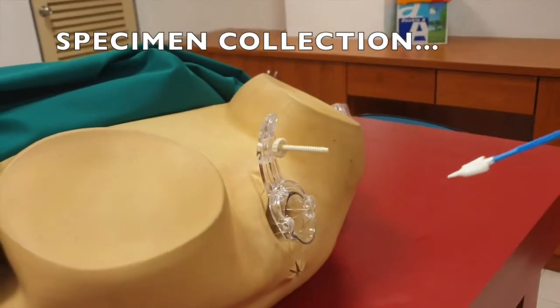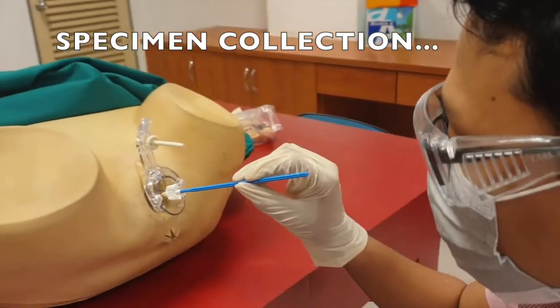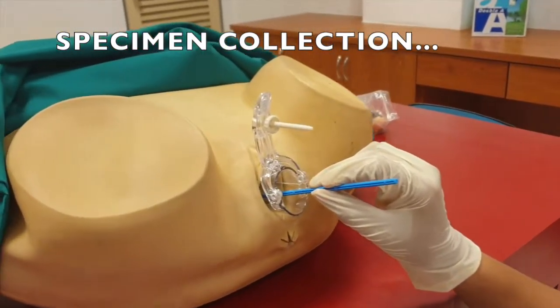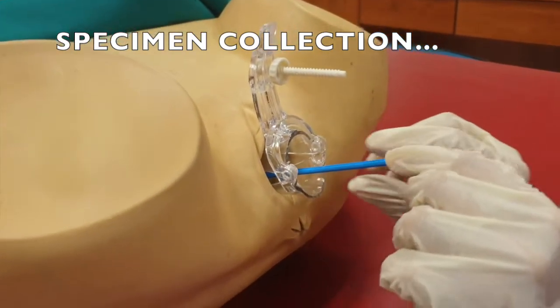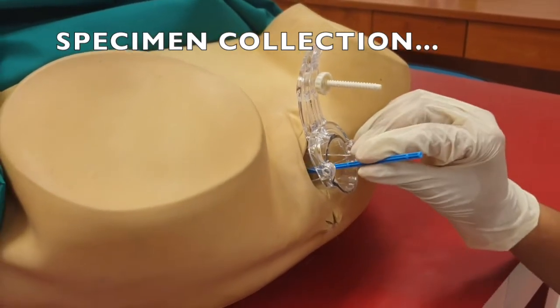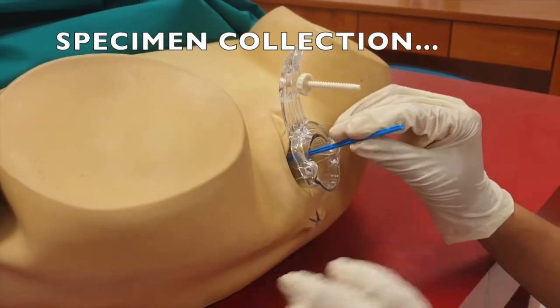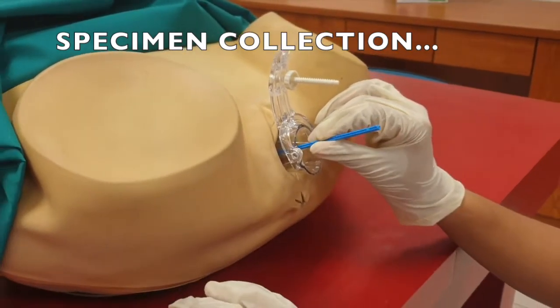Okay puan, saya nak ambil sampel sekarang puan. Mungkin ada rasa tak selesa atau sakit sikit lah. Make sure that the brush does not contact the surface of the speculum, and then you reach until you reach the external cervix, the ectocervix. From here you rotate it clockwise about 5 times to collect the specimen, and then you remove it.